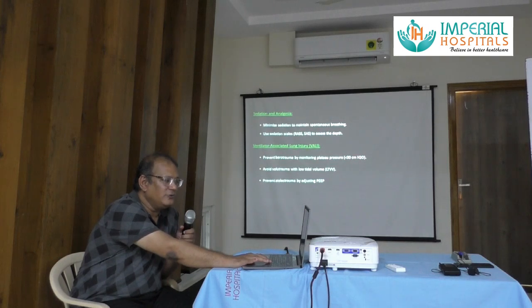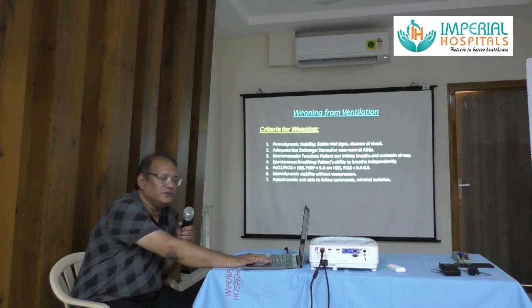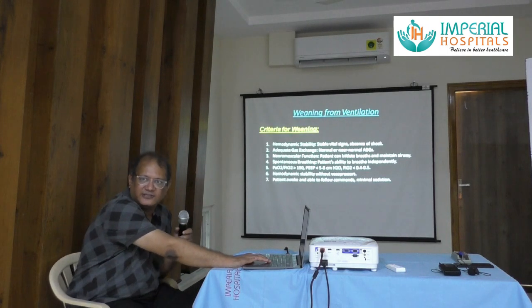That is to prevent barotrauma by monitoring the plateau pressures, avoid volume trauma with low tidal volumes, and prevent atelectrauma by having PEEP, right? So that is care of a patient on a ventilator, right?